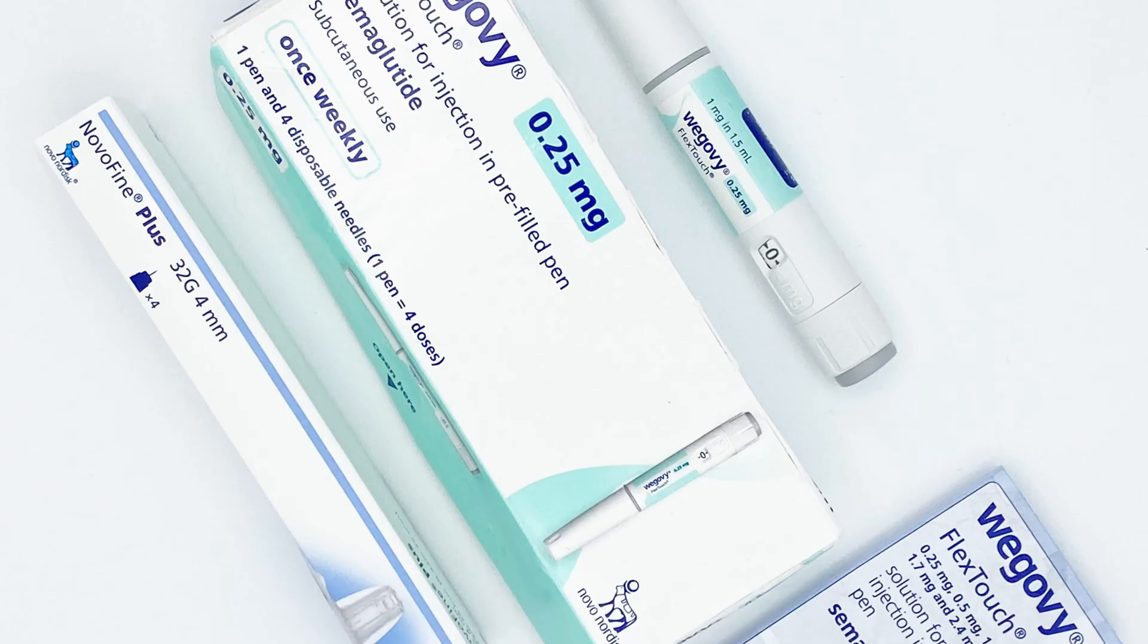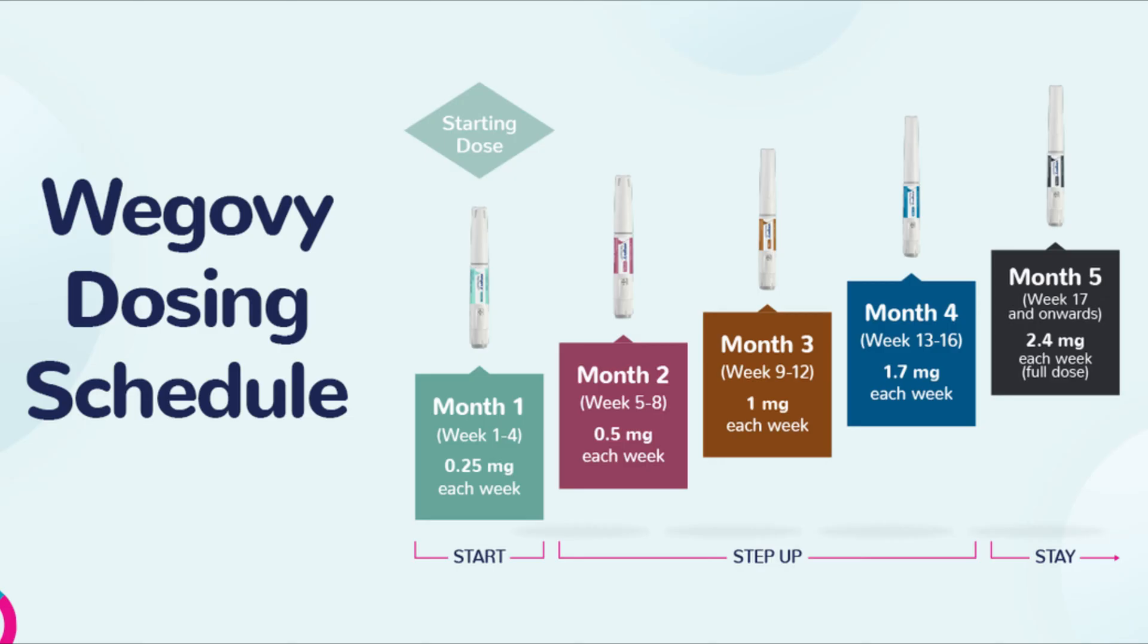Each Wegovy pack comes with one pen, four needles, and a patient information leaflet like you see here. You will use one pen each month. Each pen contains four doses which are injected once weekly. We'll talk more about the dosing later in the video.